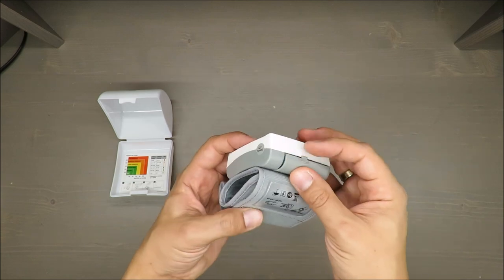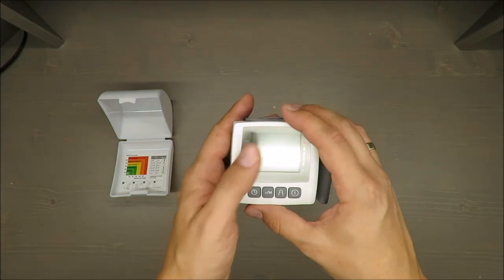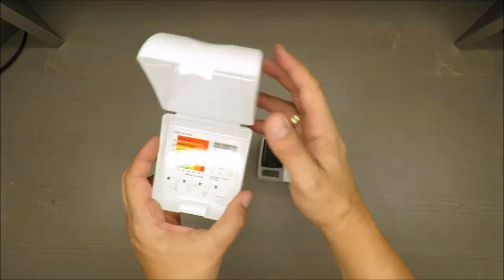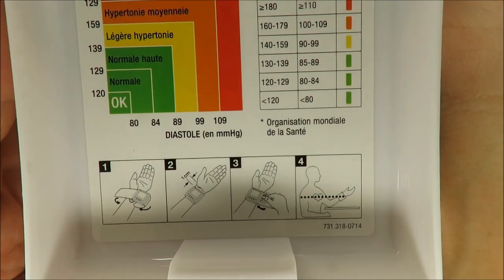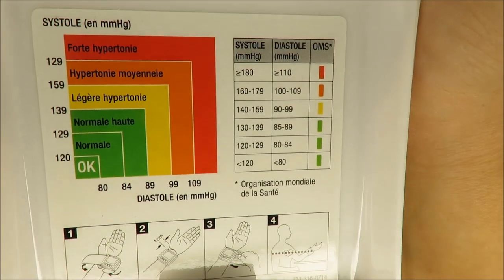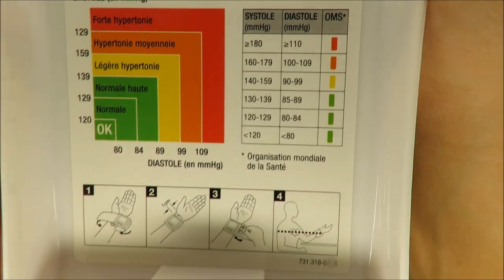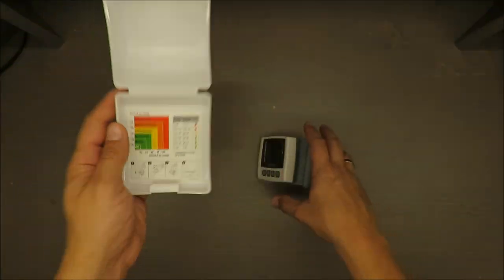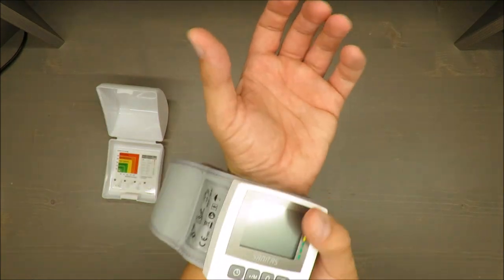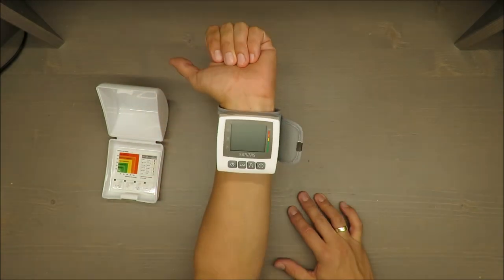I think that's all — it's a simple device. I will now run it. The interface is in German, but the digits and numbers are international, so that's fine. Now I will put it on and you will see.